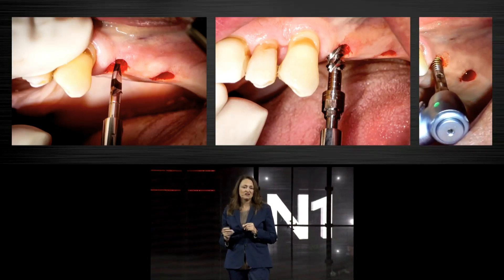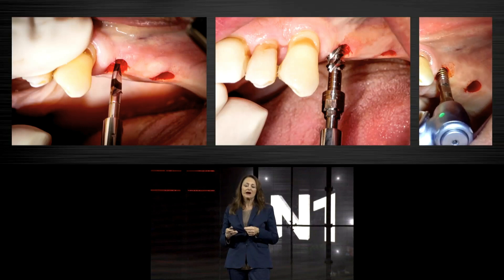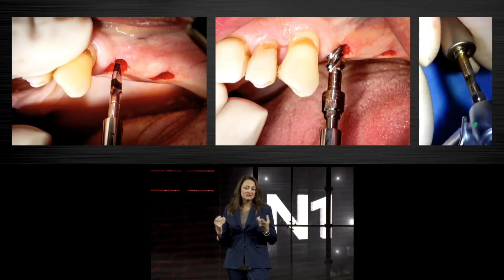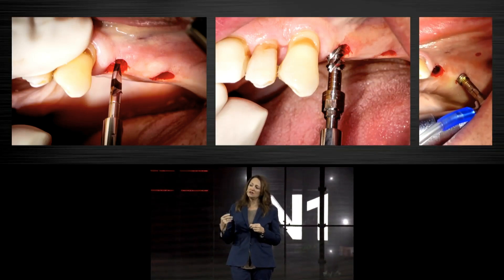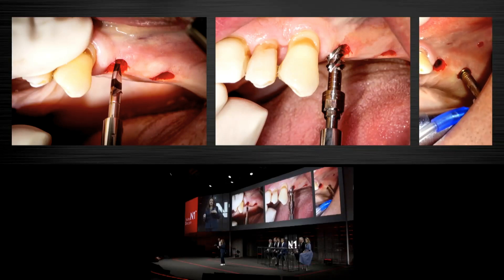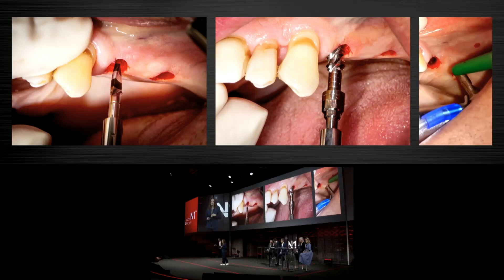The implant itself easily engages the osteotomy and follows it just like the osteo-shaper did before. In this flapless procedure, it's really easy — due to less or no irrigation — to see the lines on the implant driver. It's an easy pickup and an easy installation of the implant. On the implant driver there's a flat part where you can see the orientation of your implant when going for flapless surgery.